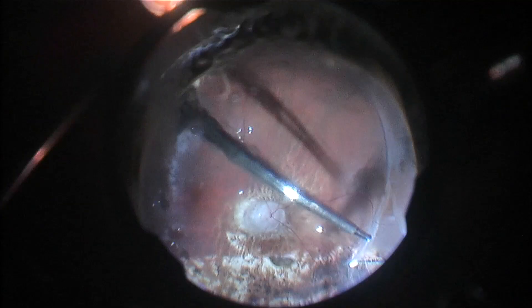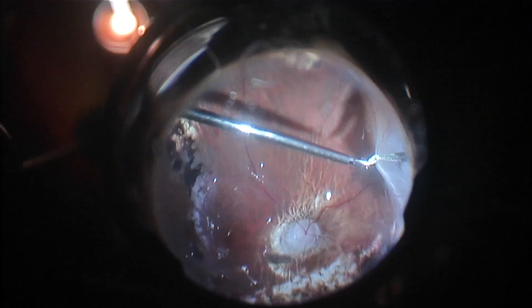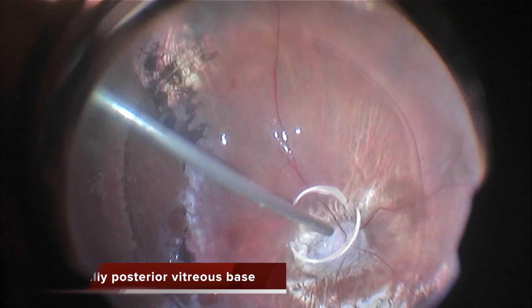I am grasping this vitreous and opening this vitreous tunnel. It is an abnormal vitreous, and there is a very adherent posterior vitreous base, and then a tunnel of vitreous that can be dissected from the ora serrata to this vitreous base. So quite abnormal.